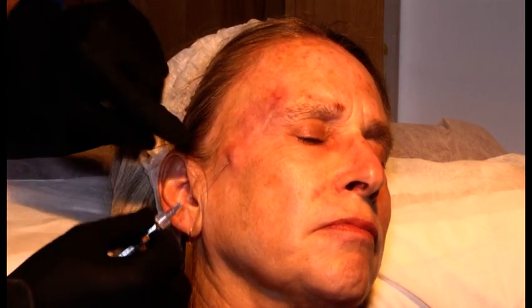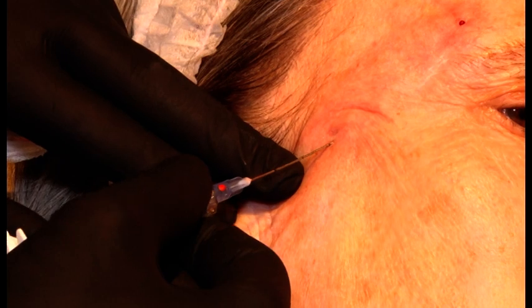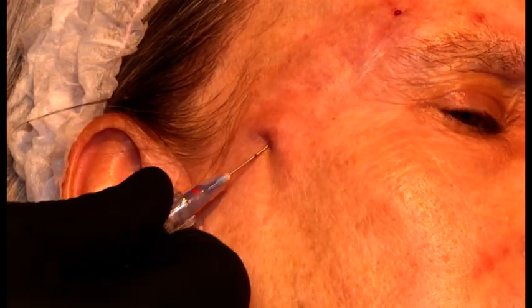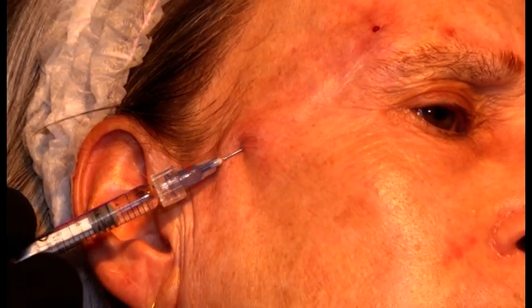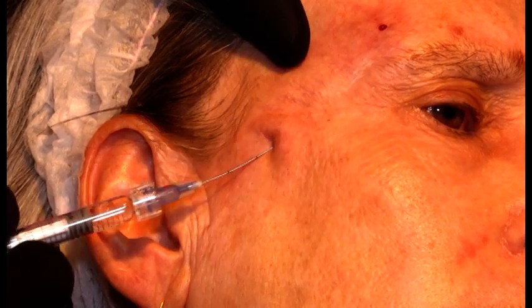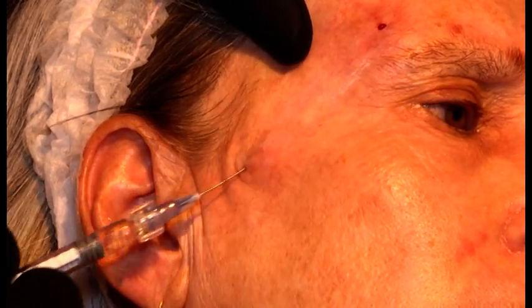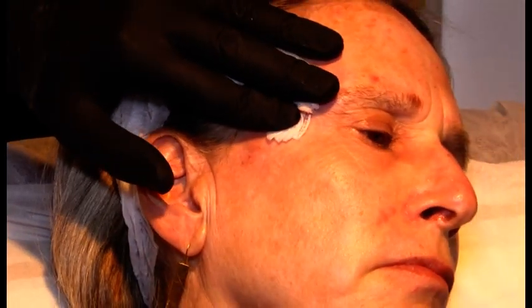Now, I also will start from the lateral cheek entry point. This is subcutaneous, and I want to go one level down. So I go down, click. So now I'm below. If I pull up, it looks different, as you can see. And again, I will inject a little bit of Belotero Volume over here, just to show you two different approaches of the temporal area. In total, I've injected 0.6 now. So the last was 0.1 only.